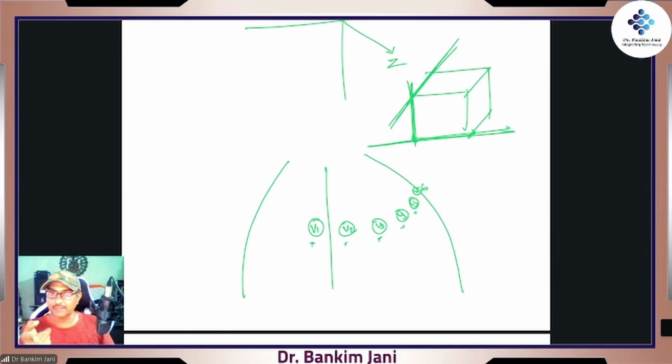So it means that if there is right ventricular enlargement, imagine a right ventricular enlargement, which of the chest leads will be showing us big waves? Right ventricular, very nice. Good one. Right ventricular enlargement. Yes, Saksha.